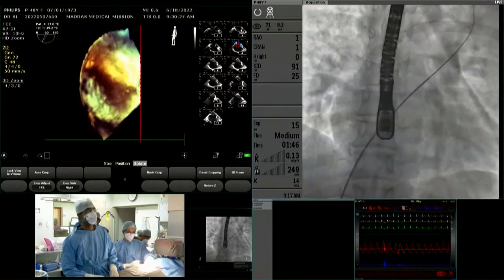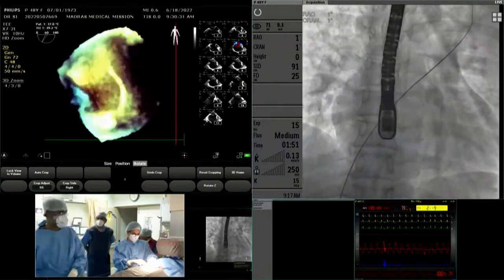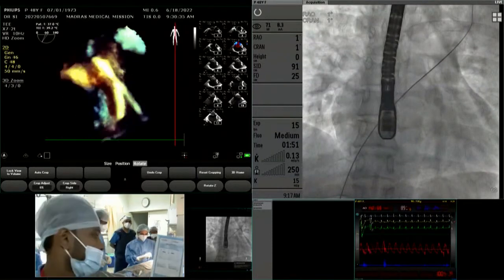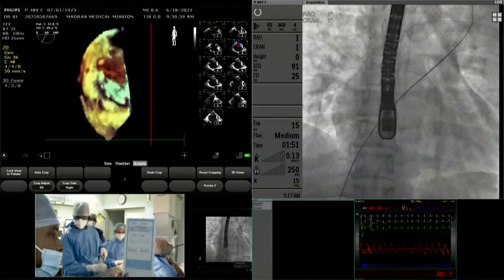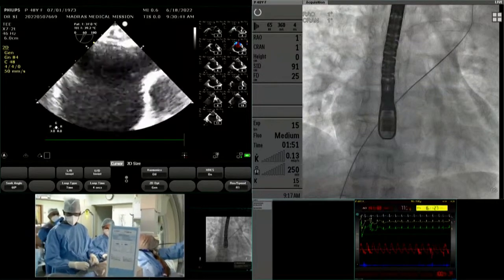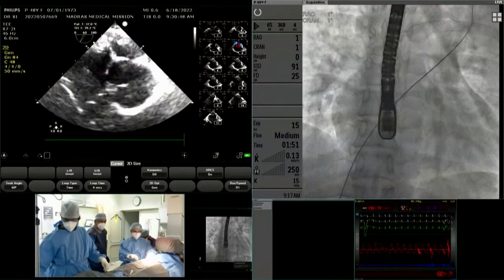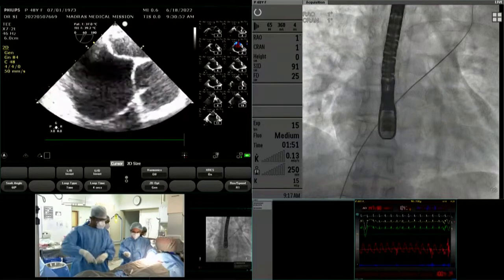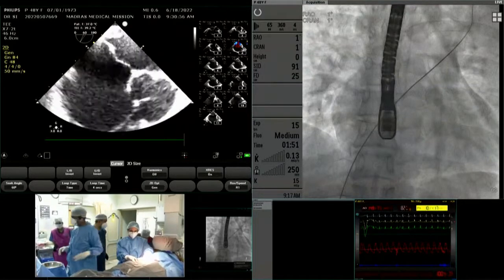Shiva, fundamental question here. Since you have two defects, two are moderate. Yeah. One is 20 millimeter, another is around 13 millimeter. And there's a good separation between that. There's a large rim there. Routinely, we stop doing a balloon interrogation for all these cases except a floppy rim, redundant septum, PFO, those things. Here, do you really think balloon occlusion is going to give an idea, or we can close the two devices like any of the single?